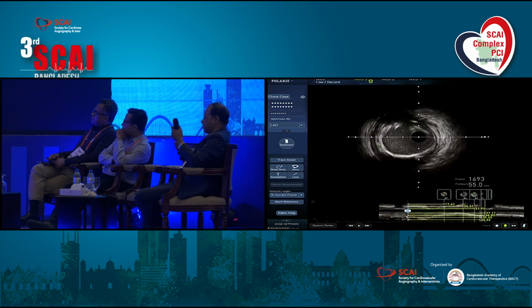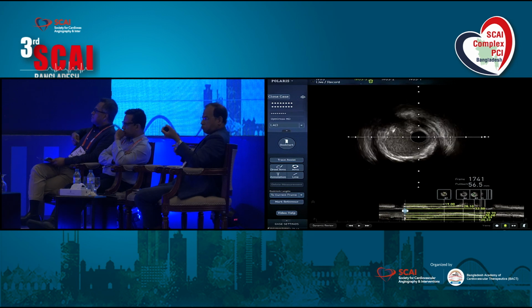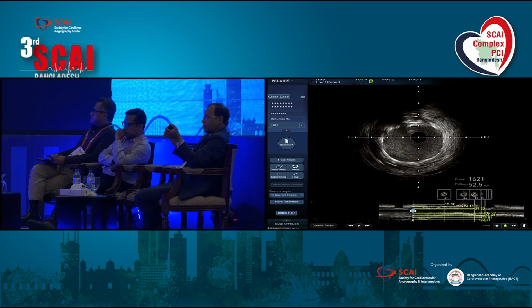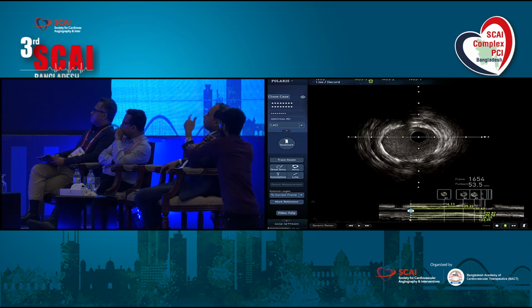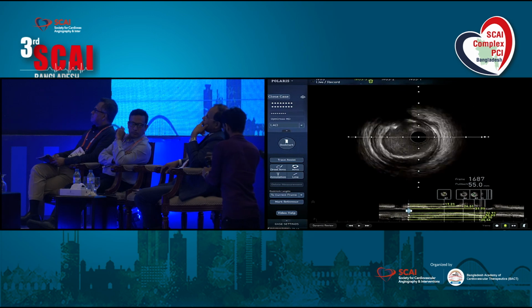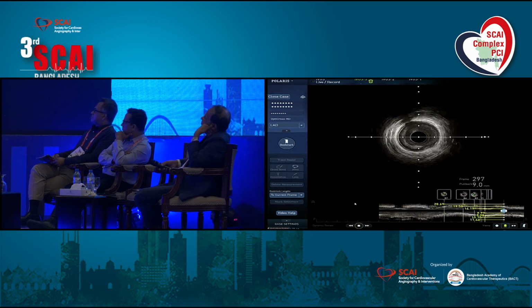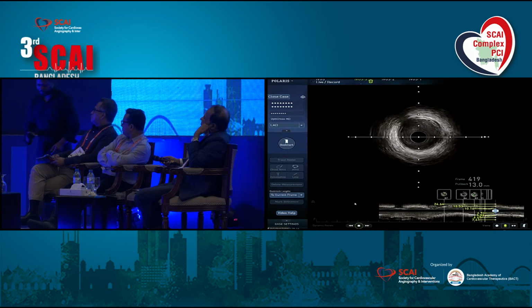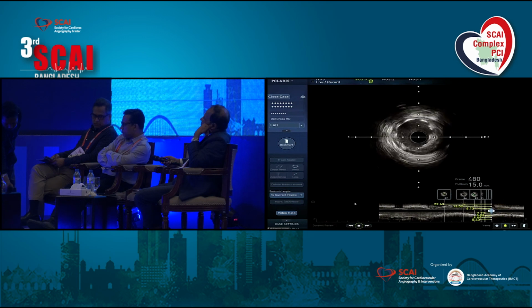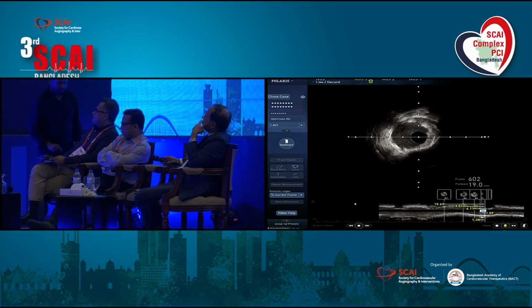But anything more than 200 is considered as malapposition, but what exactly when we should do more work to make sure it is apposed well is the question. I think they looked at 900 microns, that's 0.9 millimeters, of course. But in OCT, we are allowing less than 300 micrometer.